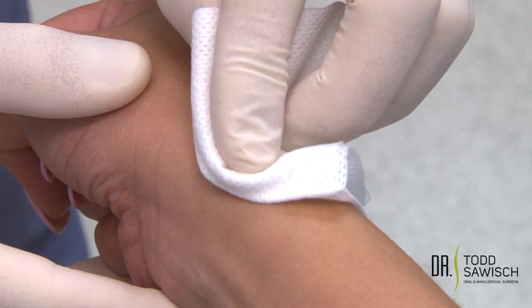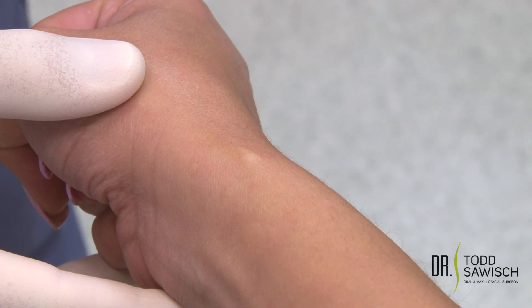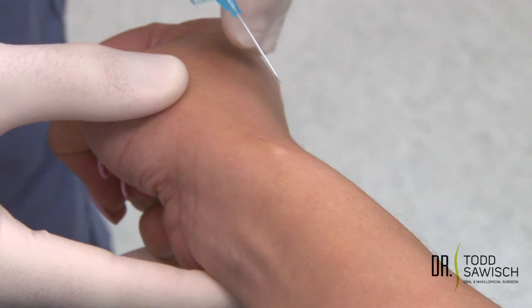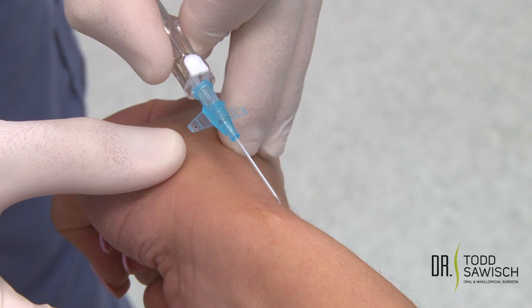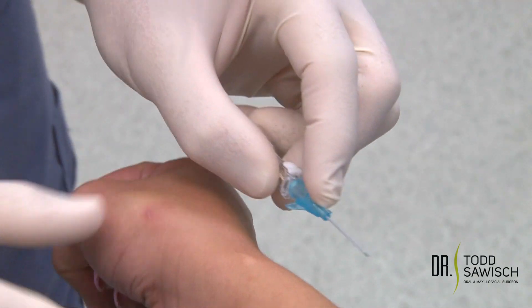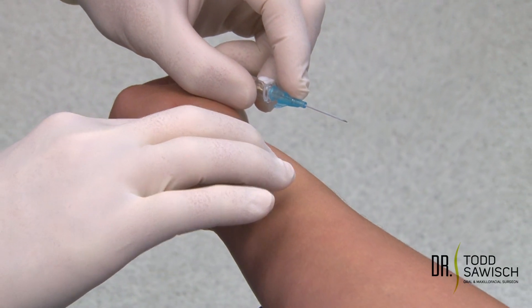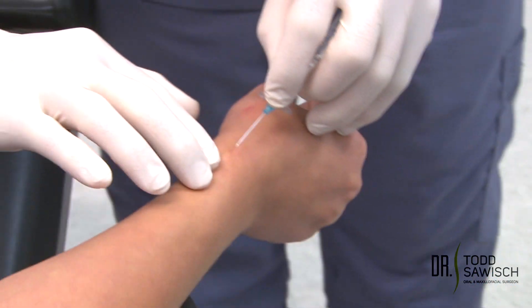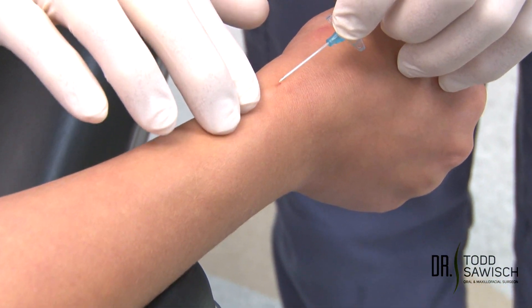I'm going to take a little gauze and wipe this off — now when we go through that specific area it's going to be comfortable. We're going to take a 22-gauge catheter, and when we insert the needle it's going to be roughly at about a 15 to 20 degree angle as it inserts into the vein. I'm going to support the catheter with my finger. The patient's arm is supported. I'm going to do a little tapping here to make the vein pop out more, and palpate where the vein is. When I insert the needle, we're going to go through the same area where we did the subdermal wheal of the lidocaine.